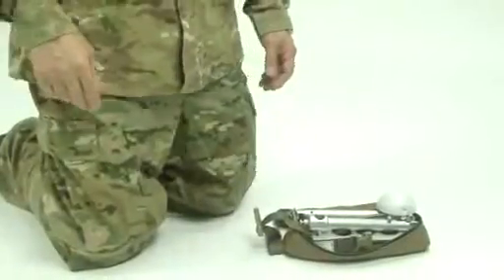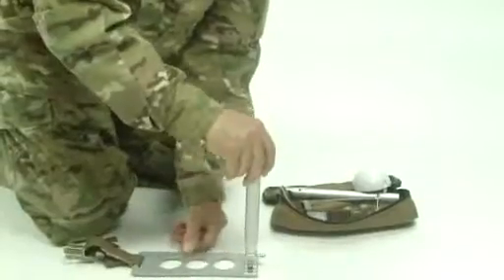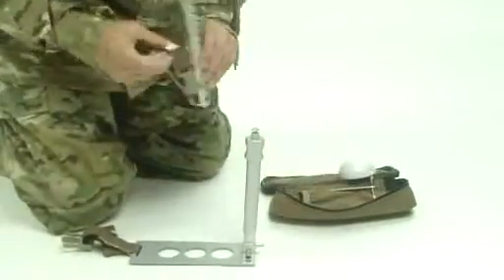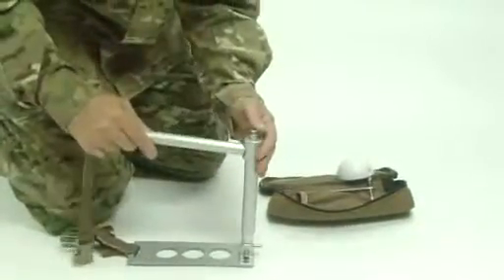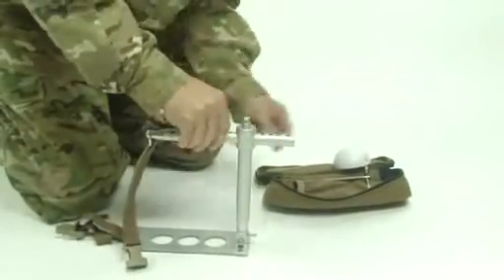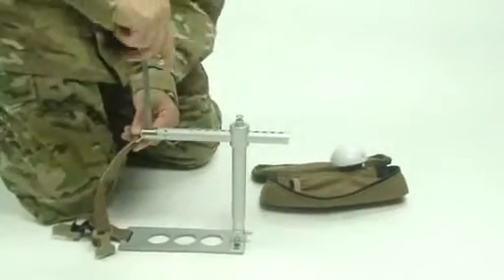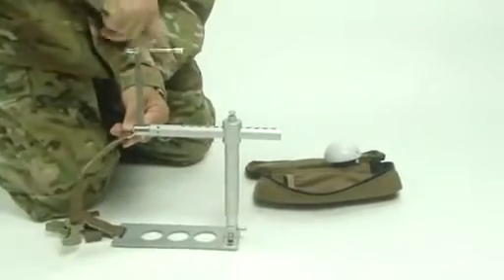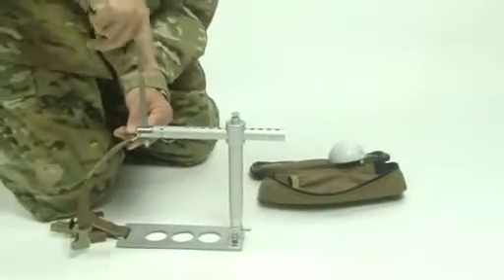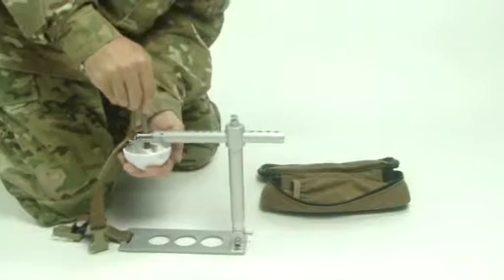To assemble the Croc, remove from pouch. Rotate the vertical arm up from the base plate, lift the horizontal arm locking pin, and insert the horizontal arm. Insert the T-handle into the horizontal arm head and rotate clockwise until seated. Attach the pressure disc head to the T-handle.